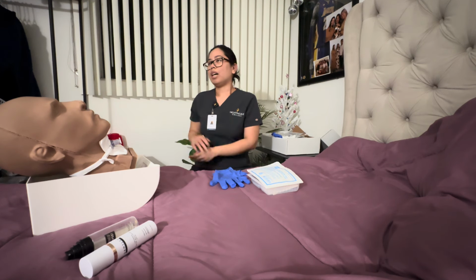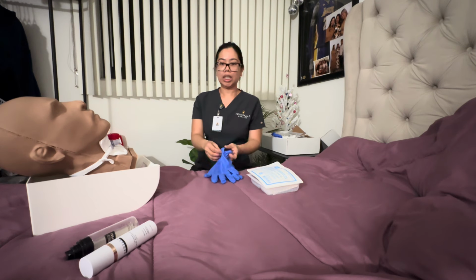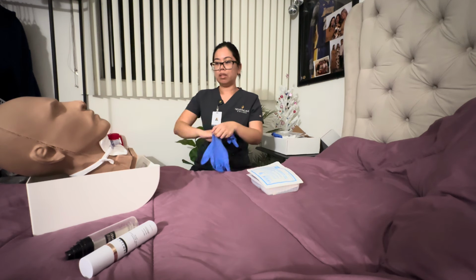So I'm going to do hand hygiene. The patient is ready. He is aware of what the situation is. He knows what to do. We already pre-oxygenated the patient. So now we're going to start the cleaning of the tracheostomy: hand hygiene, and then we put on our gloves.